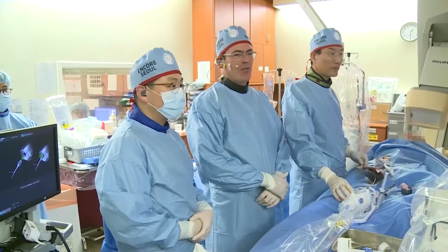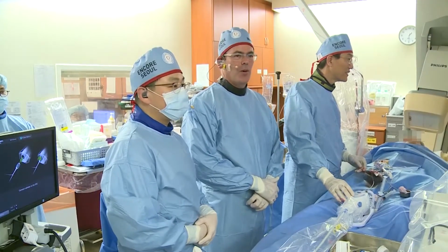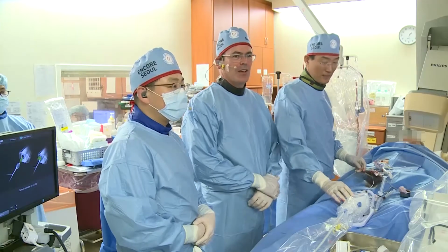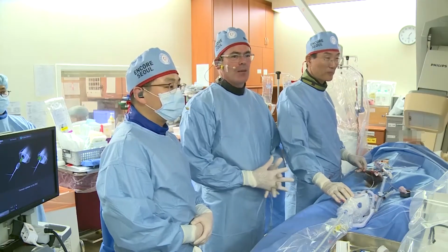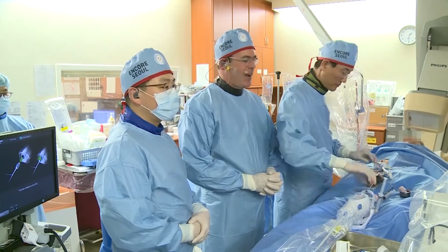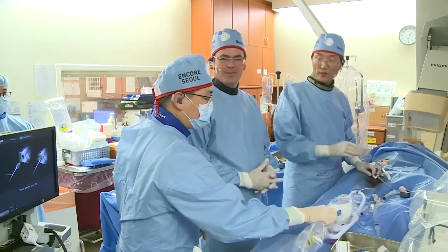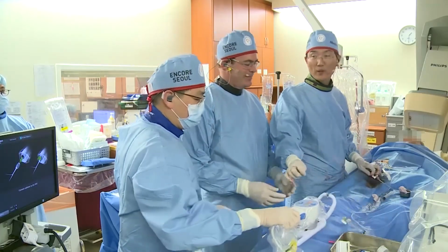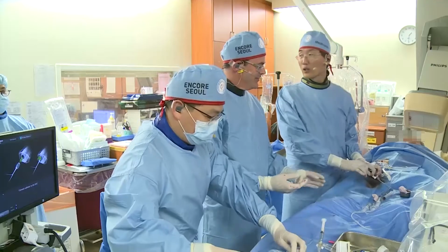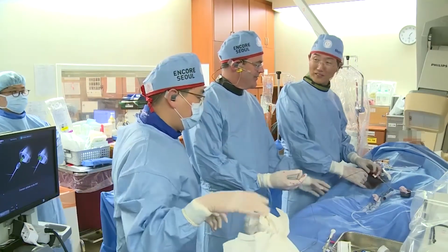Well, it's a pleasure to be here. We've started the case already, so we've made some fairly rapid progress with a case not quite as challenging as we thought initially, but I think there's some very interesting points that we can discuss. We're getting some imaging now. So the third operator is Dr. Woo-Jin Jang from Samsung Changwon Hospital, and we have no IVUS specialist because I'm special.